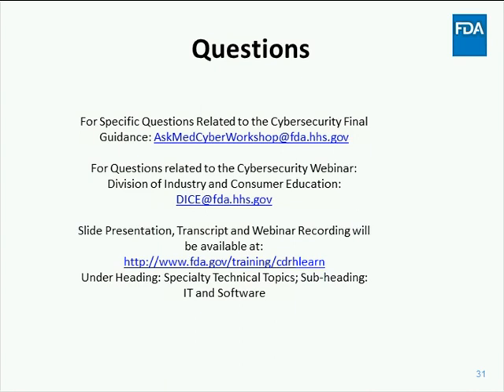That's why there's a temporal component to CVSS, because we believe the overall risk increases with time. Therefore, we've emphasized expediency and incentivized expediency. Yeah, it isn't to say that inspections of firms won't occur, and over the course of that firm's lifetime cybersecurity will be audited as well. So that's a little outside the scope of this present guidance.